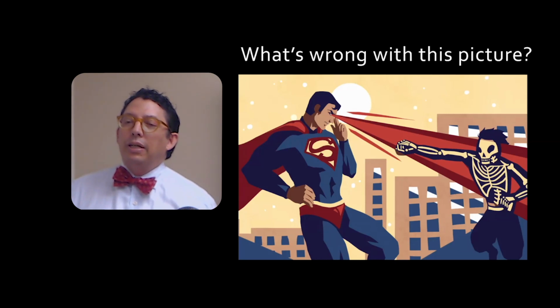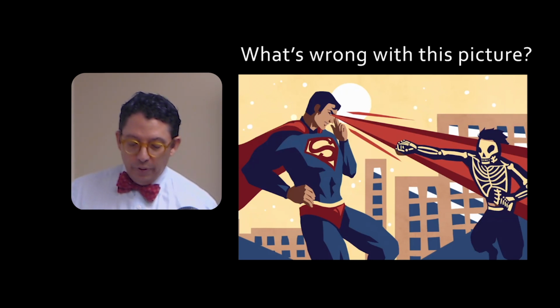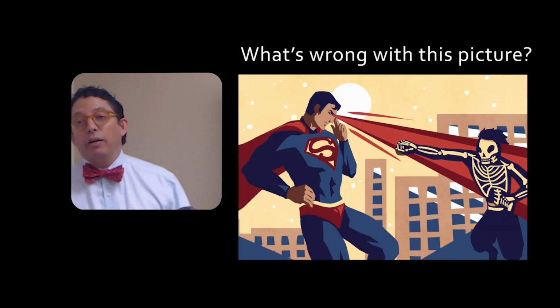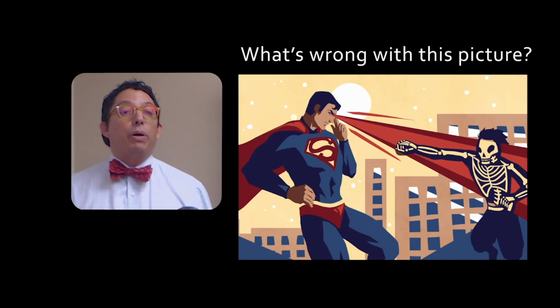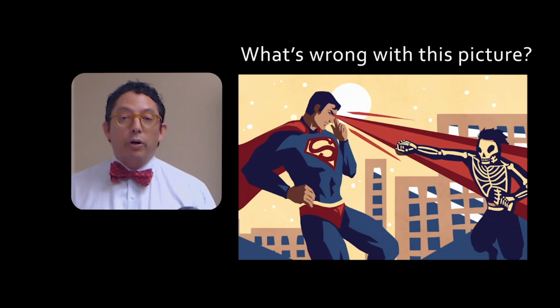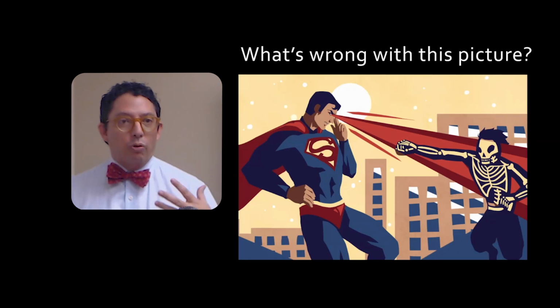So let's talk about light and let's talk about photons, because that's the principle of understanding x-rays. We are all used to looking at x-rays or photons in a different way. Typically, you have seen them in the movies, or seen people looking at them through an acetate, which is a piece of plastic, on a view box, and the view box would show us a grayscale of something inside of a body that the x-rays had crossed.